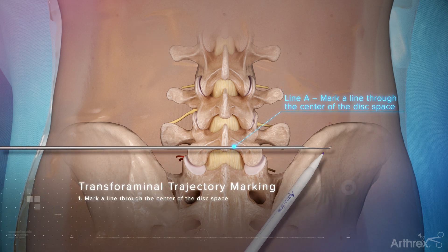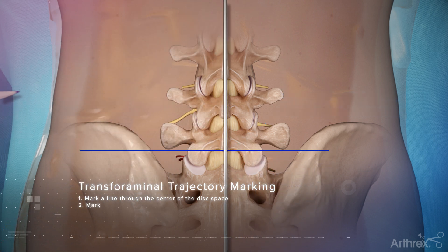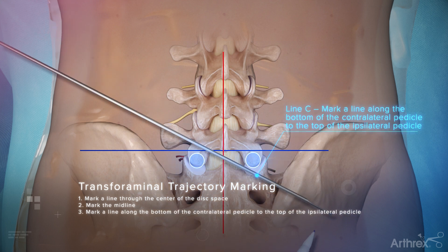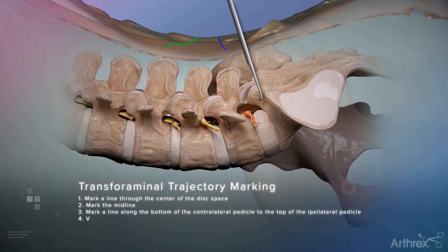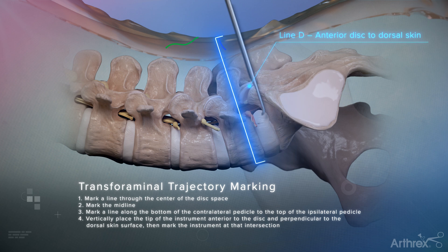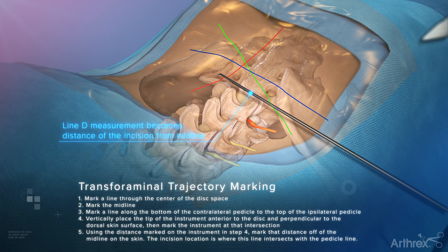Mark a line through the center of the disk space. Mark the midline. Mark a line along the bottom of the contralateral pedicle to the top of the ipsilateral pedicle. Vertically place the tip of the instrument anterior to the disc and perpendicular to the dorsal skin surface, then mark the instrument at the intersection. Using the distance marked on the instrument, mark that distance off of the midline on the skin. The incision location is where the line intersects with the pedicle line. Mark the incision.